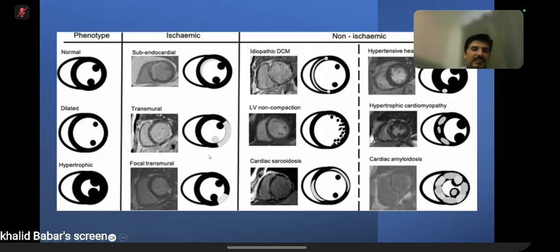Okay, so this is the ischemic pattern. So it is either subendocardial or transmural. The rest of the patterns can be mid wall, subepicardial, or diffuse as well. So all these patterns are non-ischemic patterns. Most common is the mid-wall pattern. So these are non-ischemic patterns. So differentiate between ischemia and non-ischemia. The rest of the pathologies are simple. Okay.